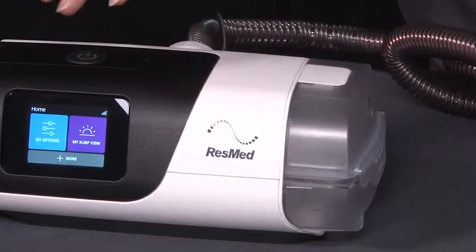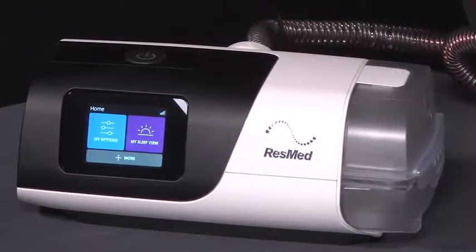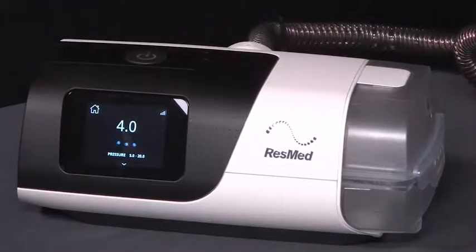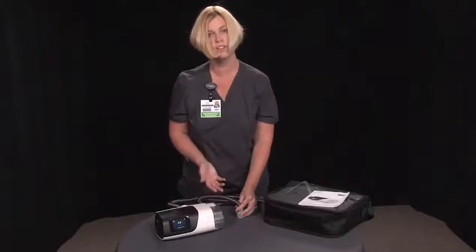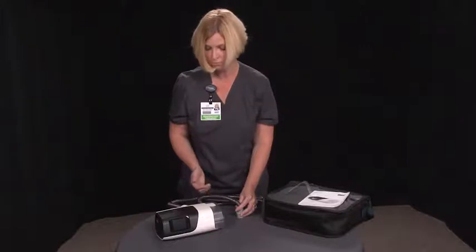The screen will time out after a few seconds. It's supposed to do that so it's not lighting up your room while you're trying to sleep. To see the screen again after it times out, you simply press the screen and it will light up again. What you see in the center is your pressure, and below that are your settings. Those are the pressure settings that your doctor has chosen for you in order to treat your sleep apnea.